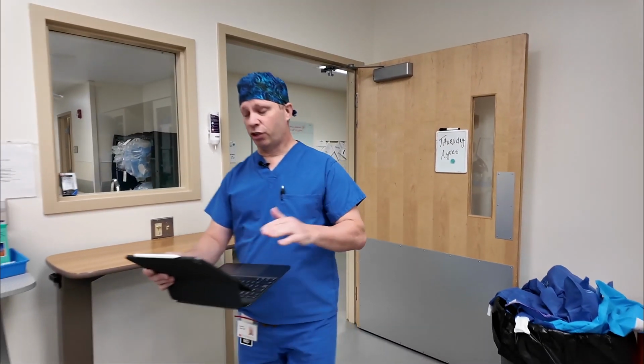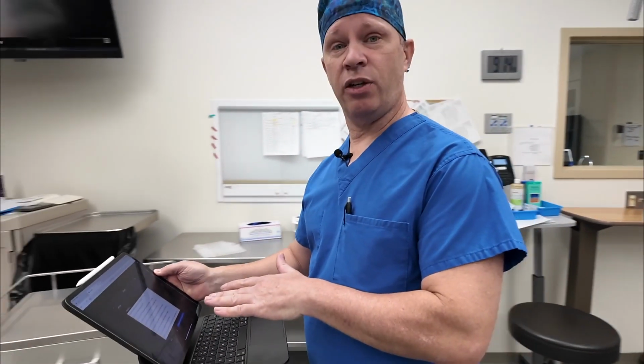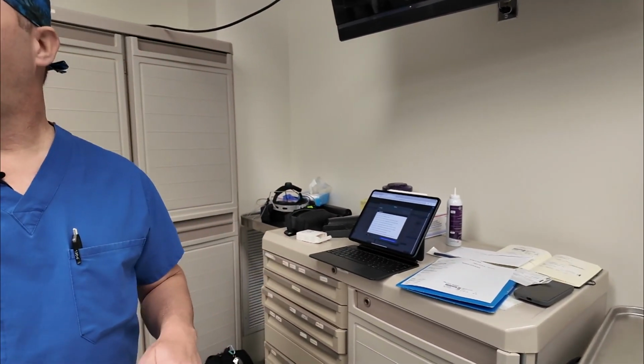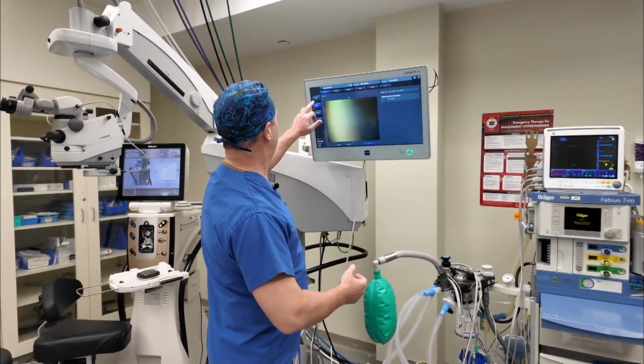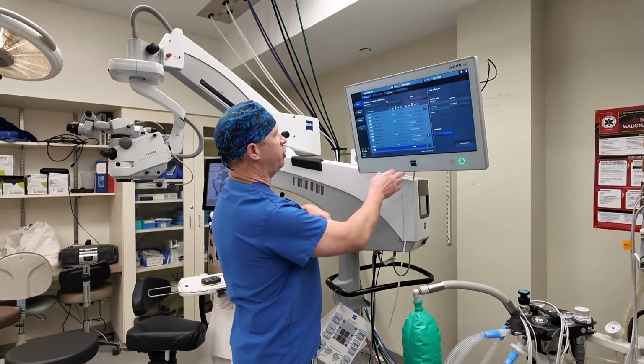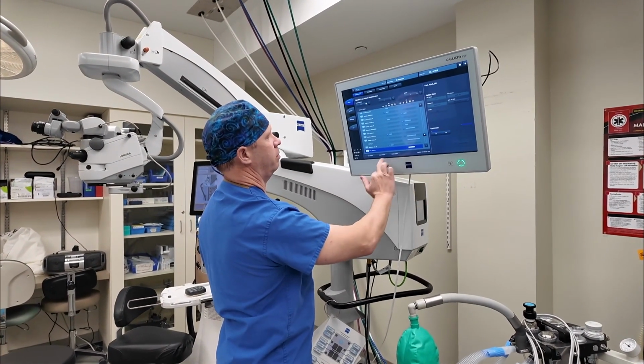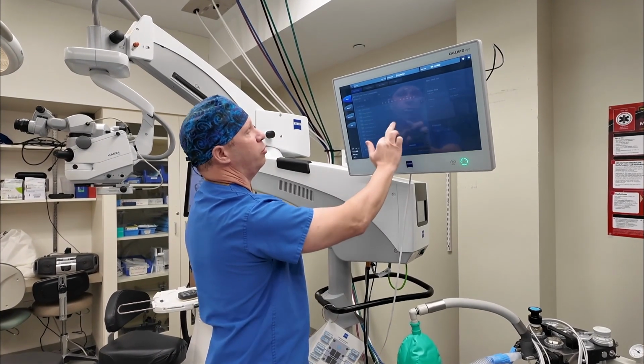All right, so the changes are already all made here in Veracity on my tablet, so let me put this down. But now we want to go over to our microscope and make sure that it connects with Callisto. So the patient's already been uploaded. I uploaded all the cases first thing in the morning, but we're going to want to go and delete that patient's chart and then re-import it.